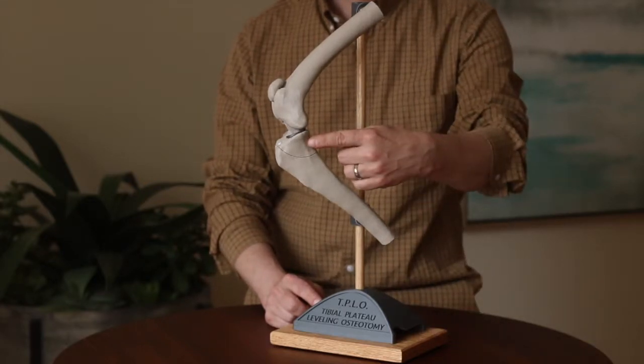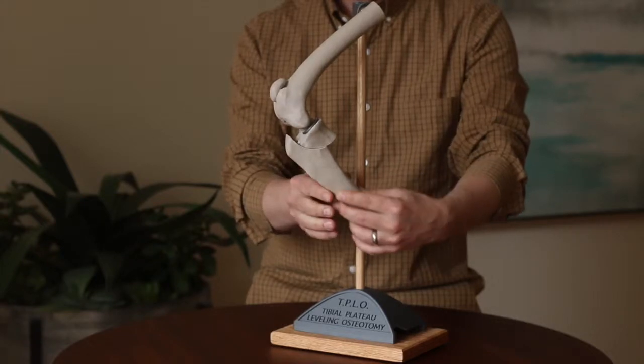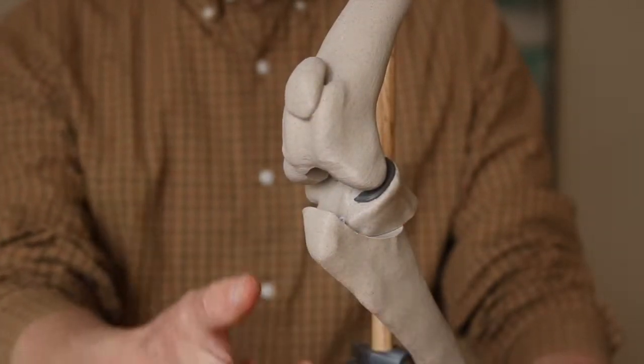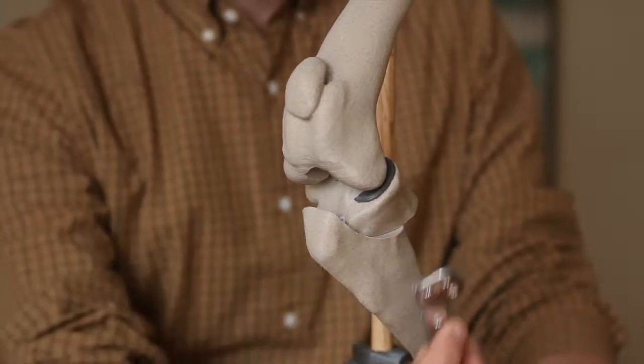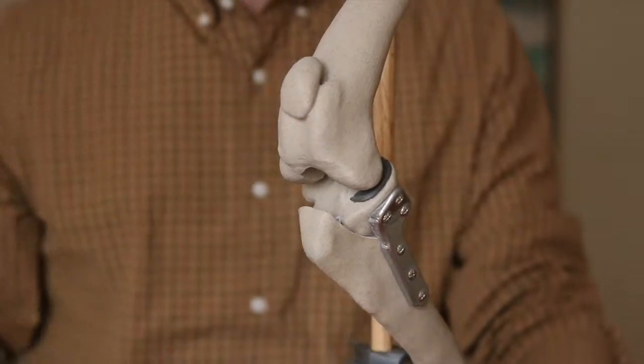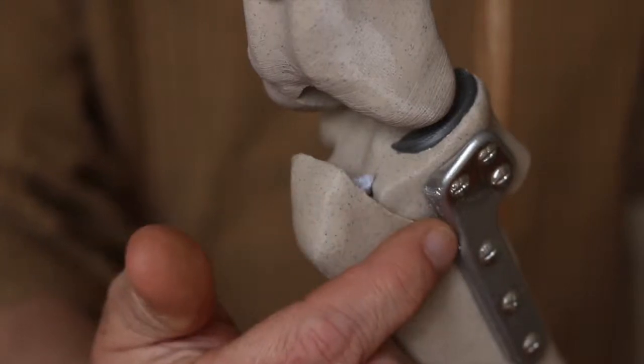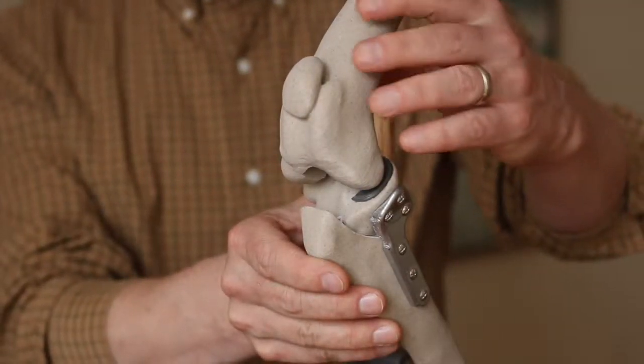And then this piece of bone is rotated by 30 degrees and it ends up in this position. Now we've cut this bone into two pieces, so we have to hold it together, and we do that using a steel plate and screws—just like if you had a broken bone. And that plate and screws holds this together until the body fuses the bone back together, and it takes about two months.